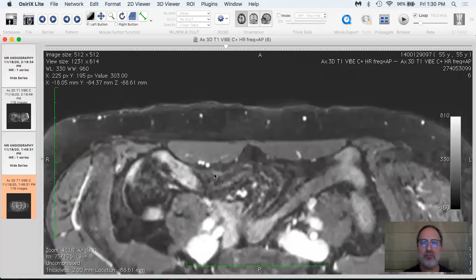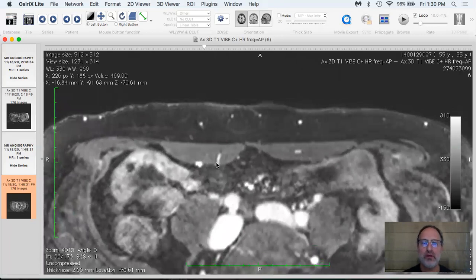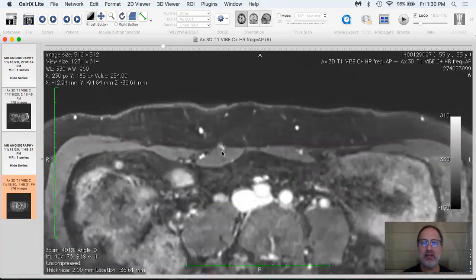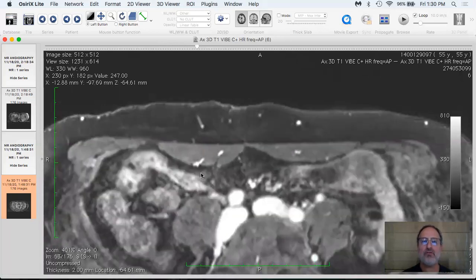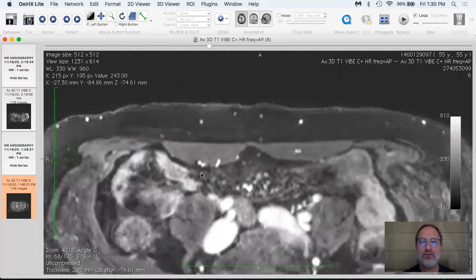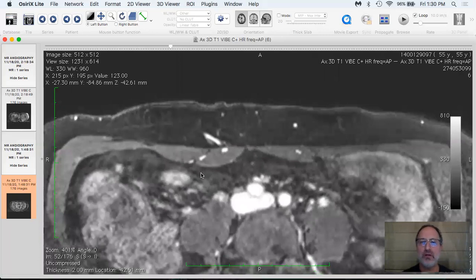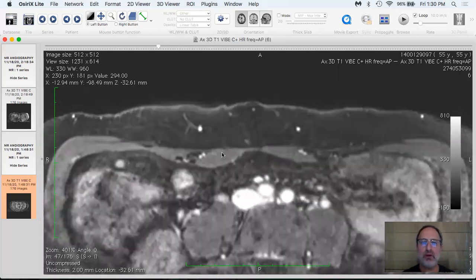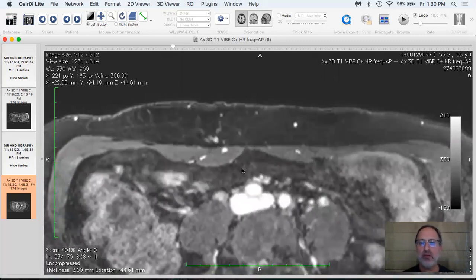And as we follow it up, you can see it gives off various branches. We call those branches perforators. And here's the one that we ultimately did, in fact, select and use in this patient. Okay, and you have your choice, and there are a lot of different reasons to choose one blood vessel over another, which will be the topic of another discussion. But this is an excellent example of a very, very nice deep inferior epigastric artery perforator pedicle that was in fact used to carry this flap and make a new breast.